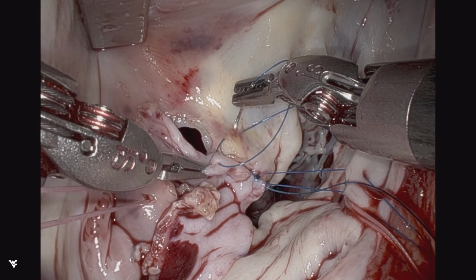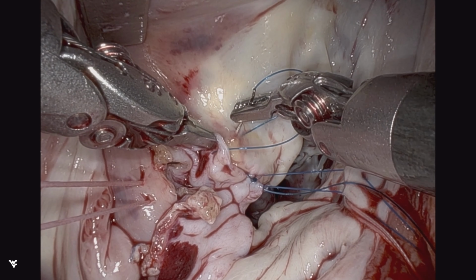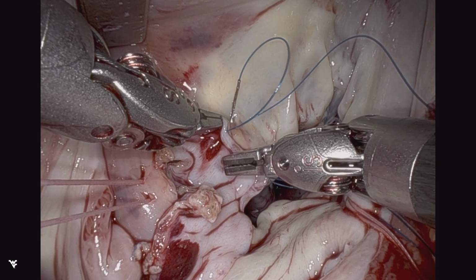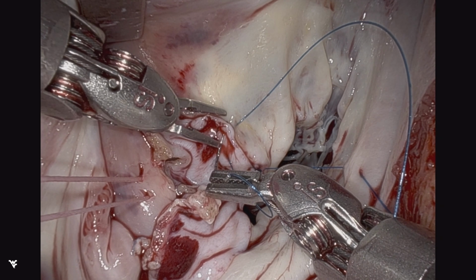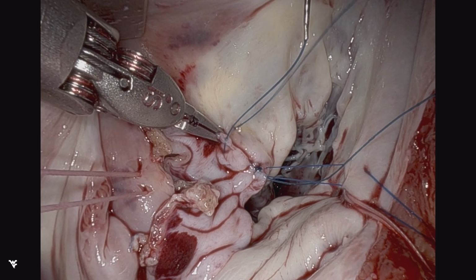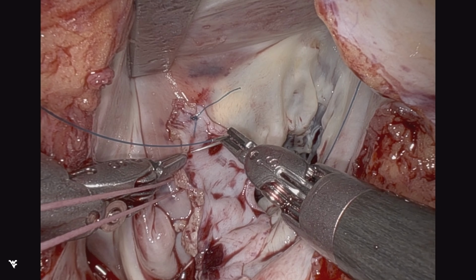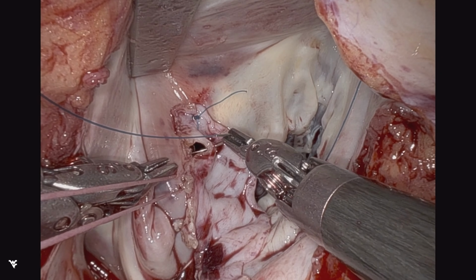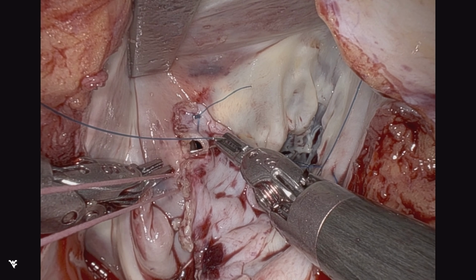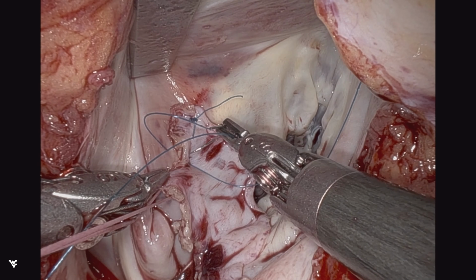This appears to be a little more challenging in that regard. So interrupted monofilament sutures are utilized to complete, and again, this is an onlay patch technique, so you can see the method of suturing to somewhat bury the stitches, and then reconstructing not only the P1 area, but the entire commissure as well as the trigone.